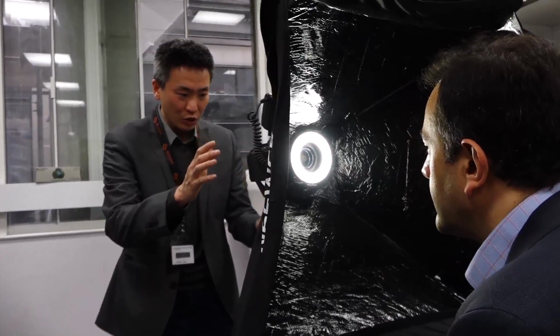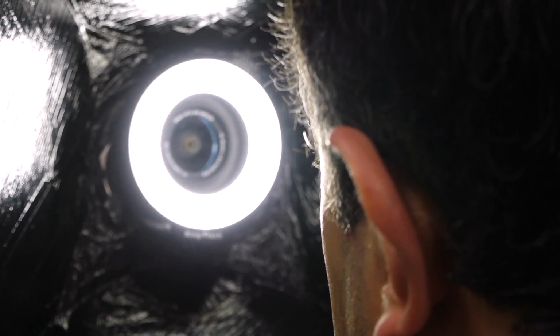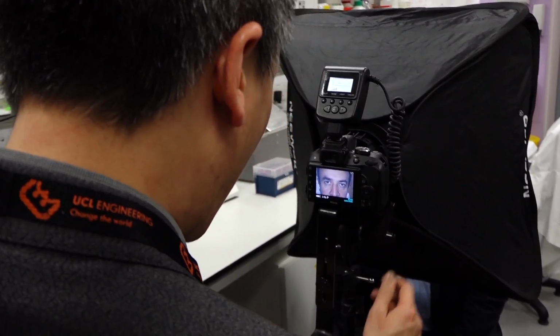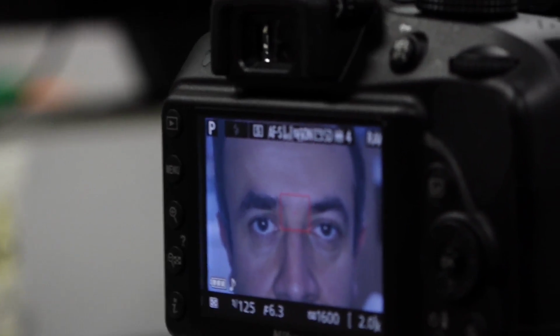Raj just mentioned that jaundice patients have yellowness in the skin. So in this technique, we want to use a digital camera and also a tailor-made illuminator to capture the color of the sclera of the patient. Now the sclera is actually the white part of the eye. This is the part of the human body which is independent of skin pigment, so we can capture the yellowness of jaundice more accurately.